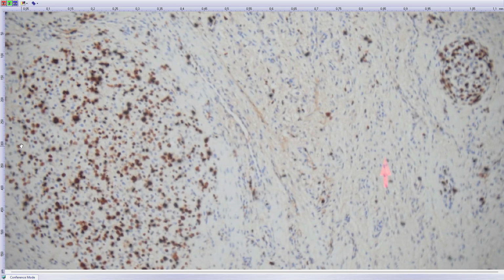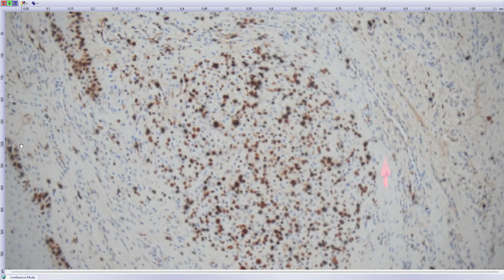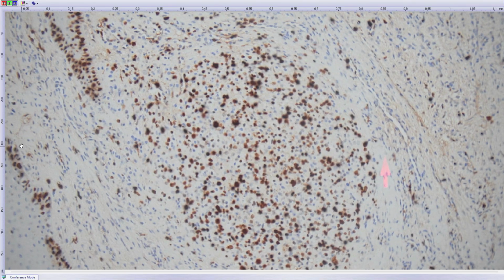Displaying benign morphology, but you see MIB1 is so positive like it is here. If it would be a benign lesion, I mean nevus cells, you would hardly see any MIB positivity, only rare from here and there, but nothing like that. Yeah. When you add PRAME positivity, p16 negativity, the diagnosis is fitting to this tumor.